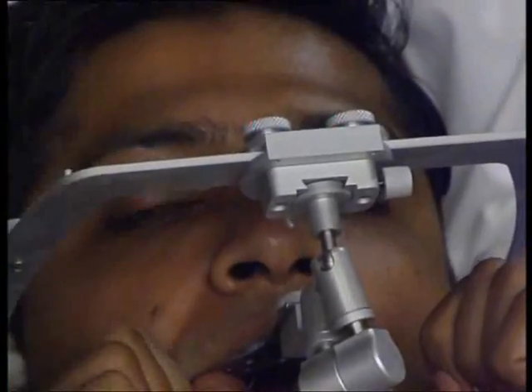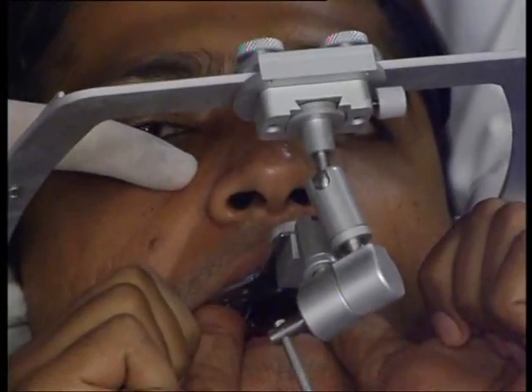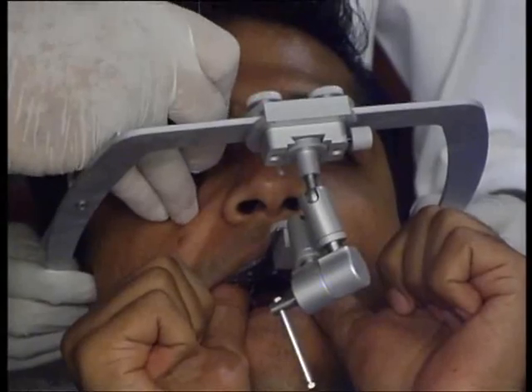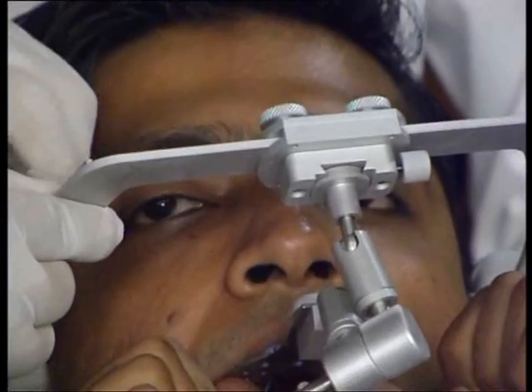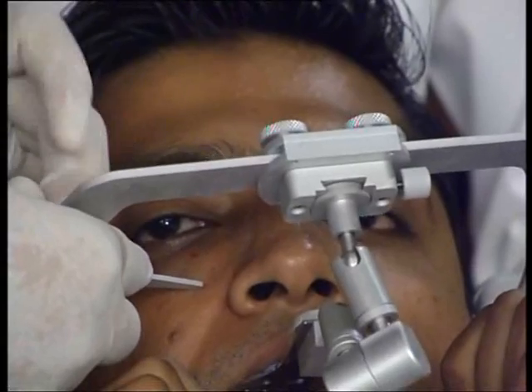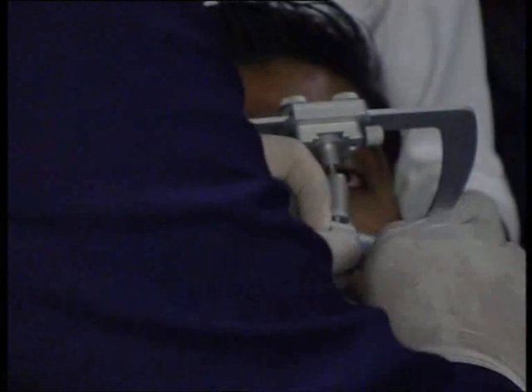What you will do now is mark the anterior reference point. Palpating somewhere around here — this is where I feel the ditch. So I will mark that area with a permanent marker, just a small dot. I will open up this. See that anterior reference point coming in? All I need to do is lift this, orient this to the third point of reference, and lock this off.